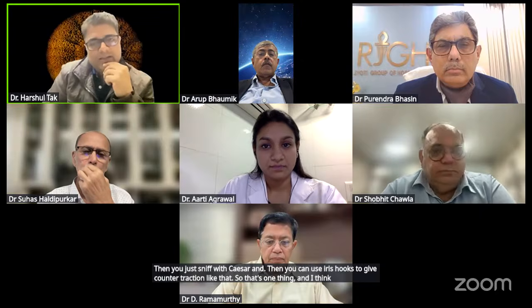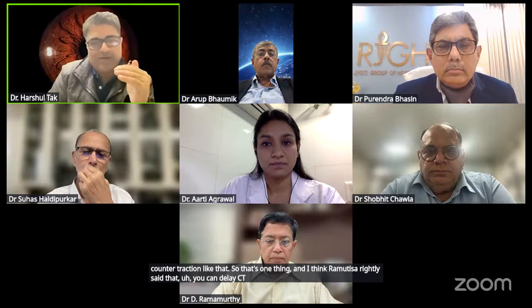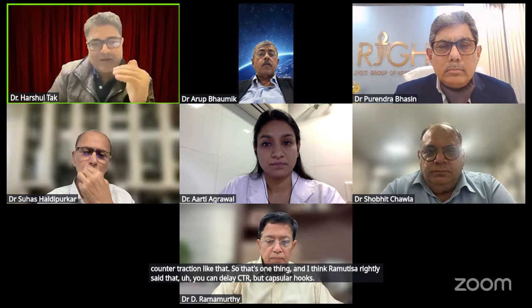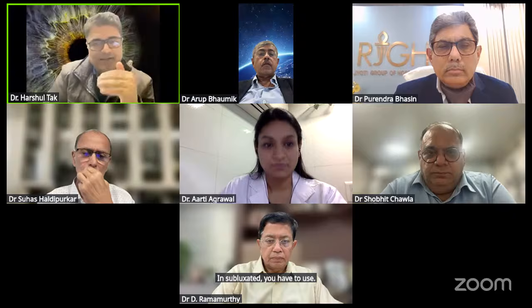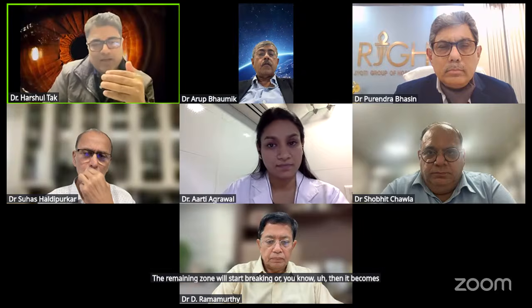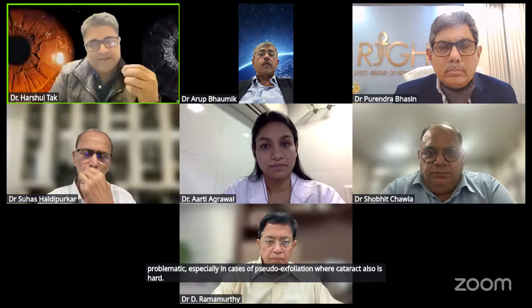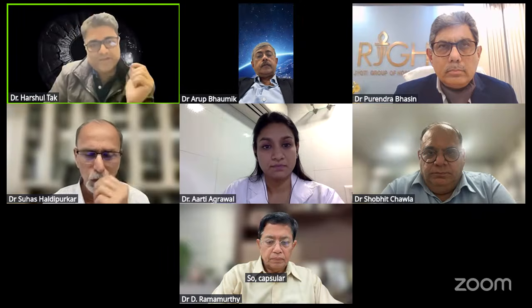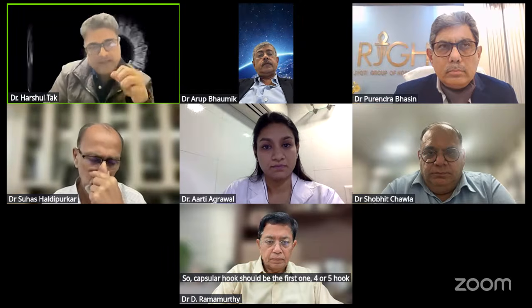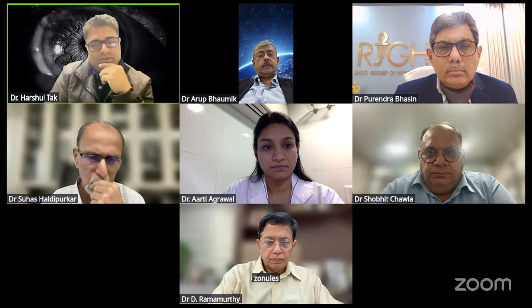And I think Ramamurthy sir rightly said that you can delay CTR, but capsular hooks in subluxated cataracts you have to use in the initial stages, because once the remaining zonules start breaking, it becomes problematic, especially in cases of pseudoexfoliation where the cataract is also hard. So capsular hooks should be the first step. Four or five hooks should go in and stabilize, because they act like artificial zonules.